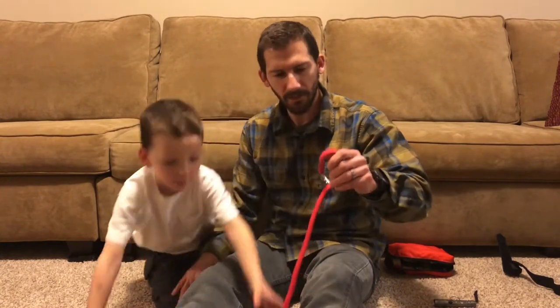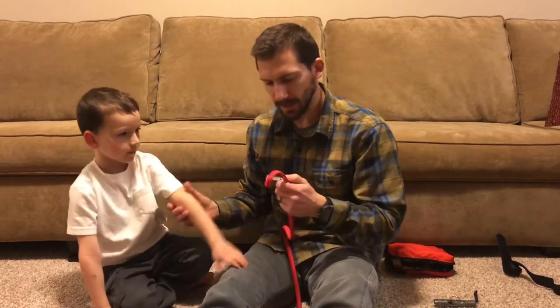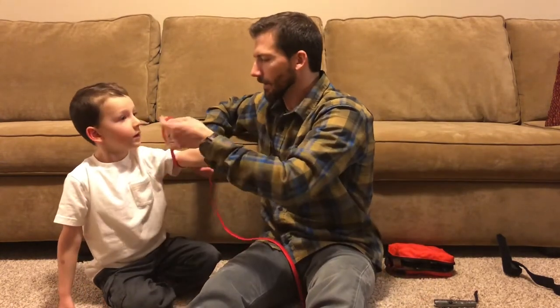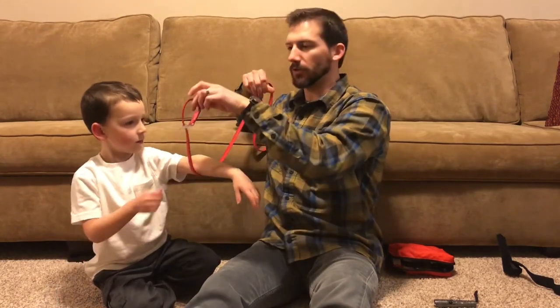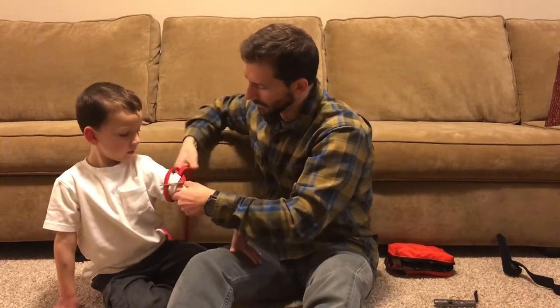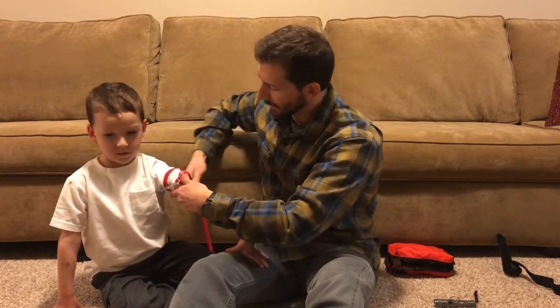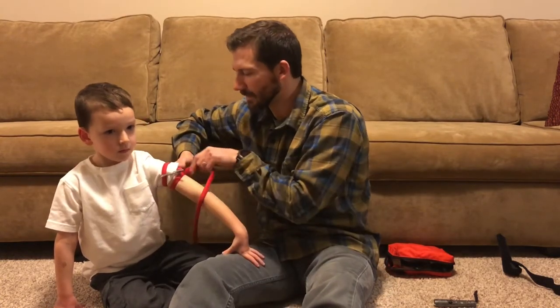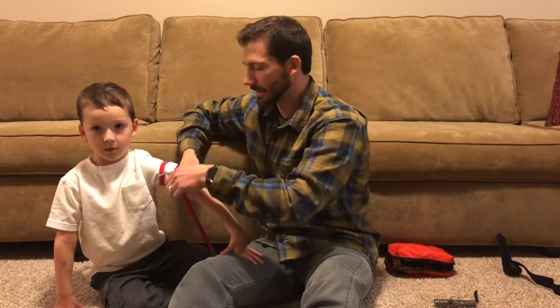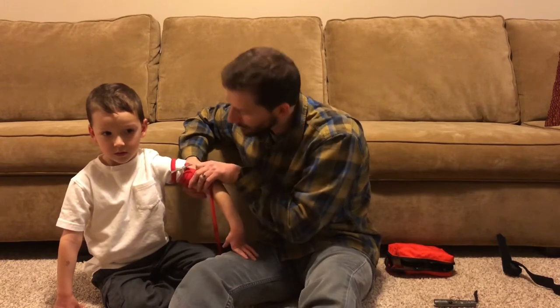The Rapid Application Tourniquet, or RATS, is very compact and easy to use. You can still do one-handed application on yourself, but I'm going to demonstrate on my son. I take this, feed the tail through the loop, and position it two to three inches above the wound — getting it as high up on the arm as I can. If you're putting this on a kid for real, you'll need to coach them: 'Hey buddy, this is going to hurt, but I need to do it because it's going to stop the bleeding.'